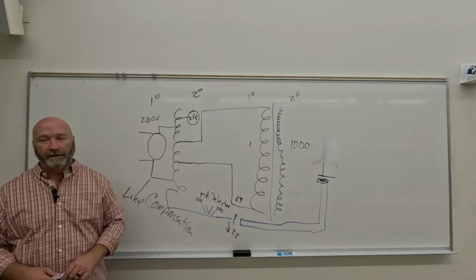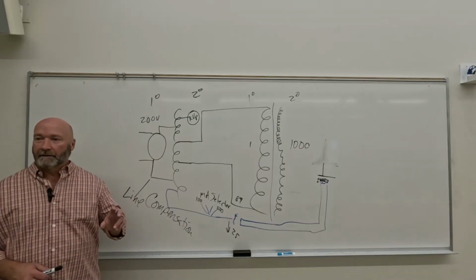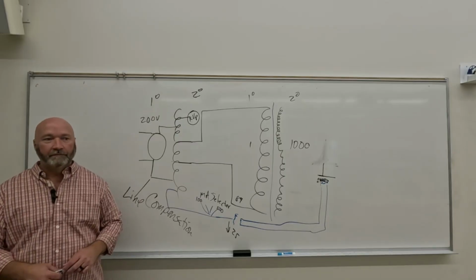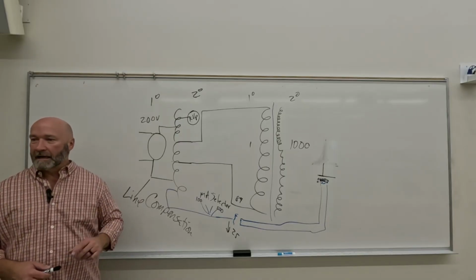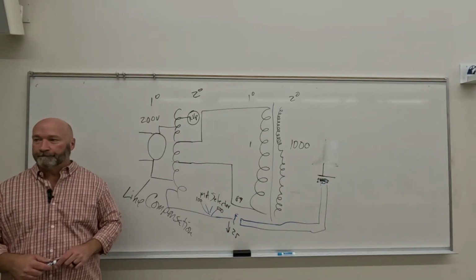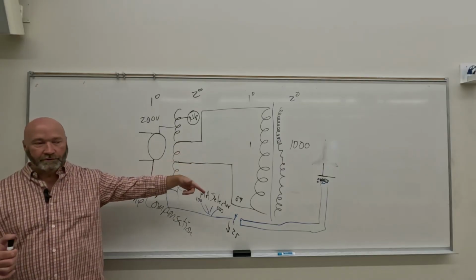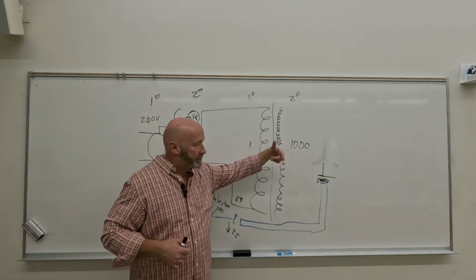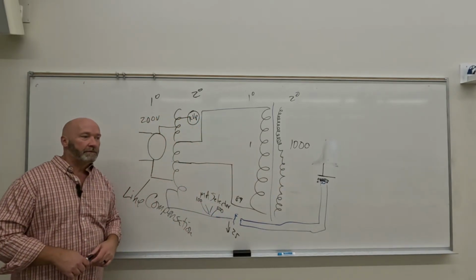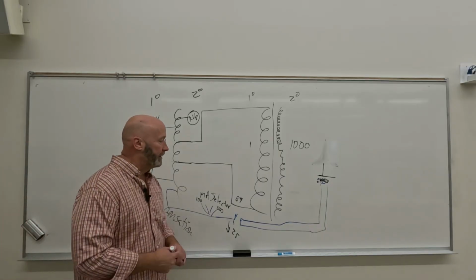As you're driving down the road, it's reading out in revolutions per minute. Take a look at it. You're driving down a road in overdrive, 70 miles an hour, and your tach is saying that the engine is only going about 1,500 RPM. So the rotor is going a lot faster, right? So we push the prep button, that spins, we make an electron cloud with thermionic emission, and we're at the point of exposure. Now this is a teaser.